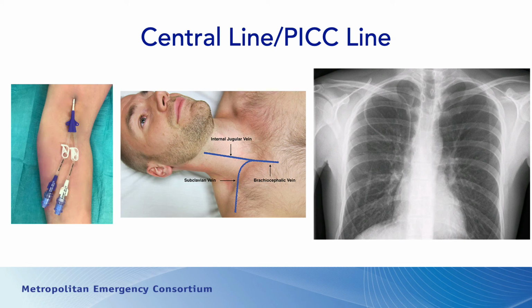You may also see central lines in patients. We use central lines at the hospital, but there are also long-term central lines like the old Broviac or Groshong catheters that may have been placed, and they are inserted for longer-term therapy. Those catheters were invented before we started using PICC lines. So I think most of the patients who would have had chronic central lines now have a PICC line instead.